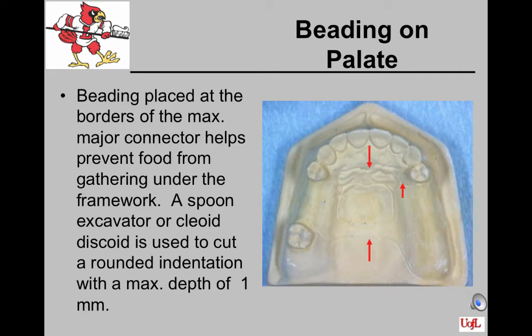It contacts the tissues. It can be allowed to do this because the tissues of the palate are tough keratinized tissues that can withstand the pressures of the partial denture under function. The exceptions to this statement would be if we have a strong median palatal suture or palatal torus. We sometimes place a thin layer of relief over these prominent anatomic structures where the gingiva is very thin and prone to discomfort and irritation by the major connector.